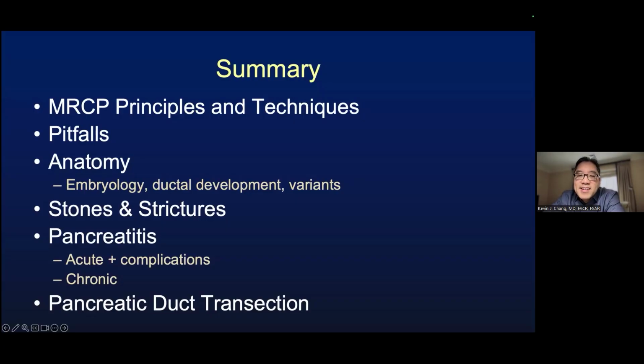That's an interesting question. I have seen some 4D flow papers out there looking at mesenteric and portal venous flow. It's definitely something that I've seen done in research. I don't know of many places using 4D flow to look at the flow patterns, especially for pancreatitis. Usually it's more for evaluation of portal hypertension, but 4D flow is not in our routine clinical armamentarium for pancreatic imaging.